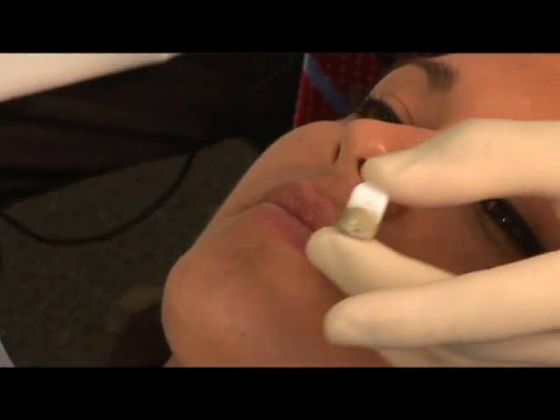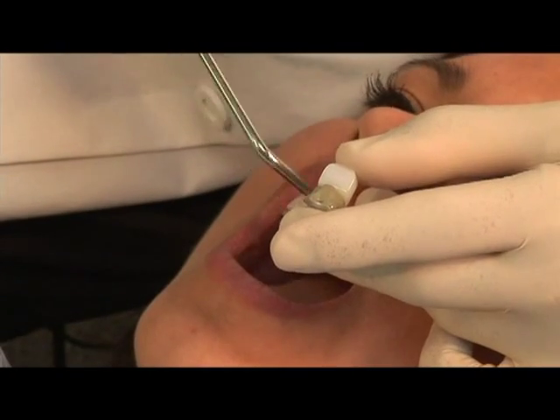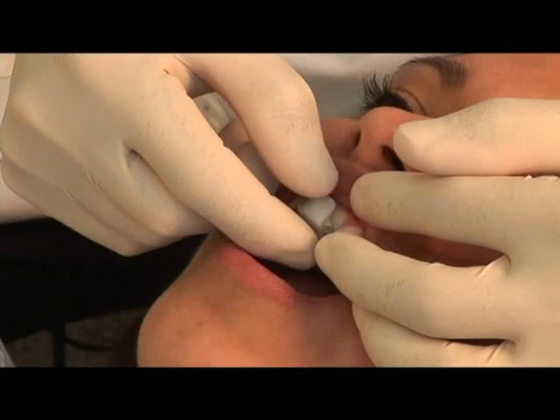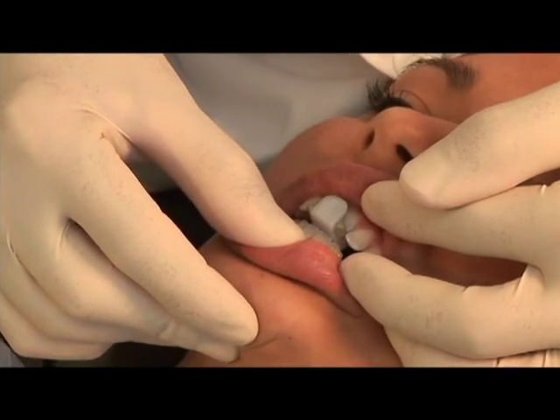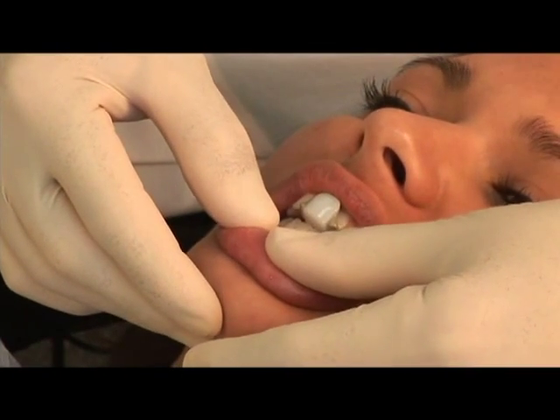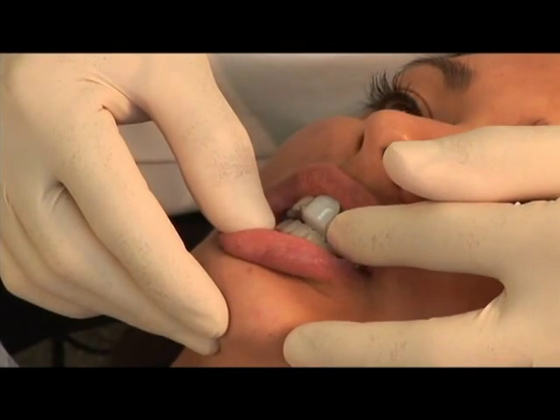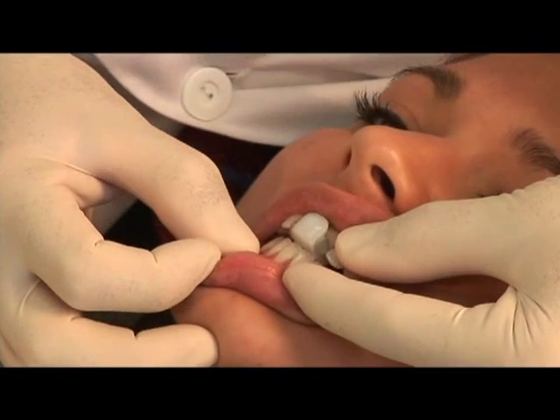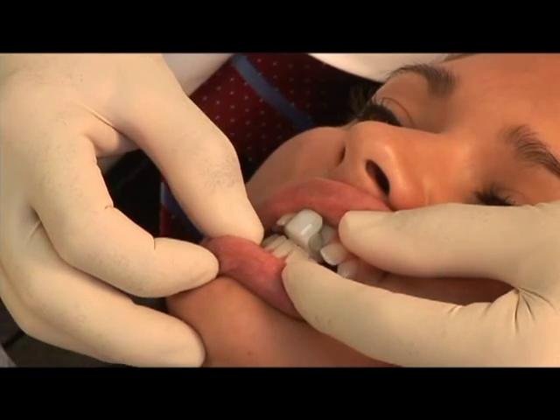An alternative to the leaf gauge is a Lucia jig. Dry the central incisors before placing the Lucia jig. Then have the patient close with their mandibular anterior teeth gently against the underneath side of the Lucia jig. Check to make sure that no posterior teeth are touching. Once neuromuscular relaxation has occurred, we will allow the patient to protrude and then retrude the mandible against the Lucia jig.